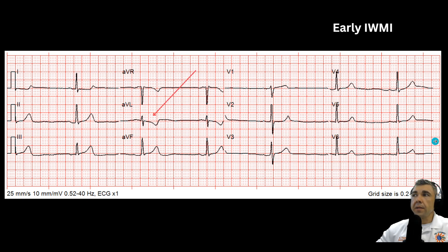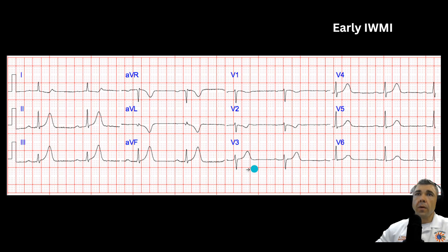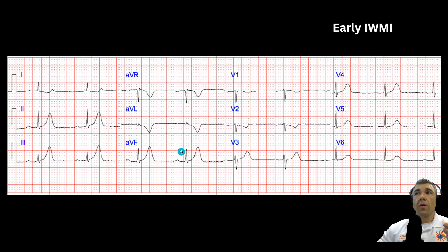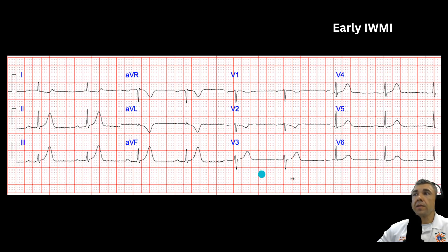Here's another one. You have the hyperacute T-waves we talked about, now in the inferior leads — big, tall, symmetrical, broad-based T-waves. Look at AVL — this is an early inferior wall MI. Look at V2 — you have a little bit of T-wave inversion starting, and that J-point is going to start to depress, so you'll have posterior wall changes as well. This is an early inferior wall MI, which is an RCA occlusion.